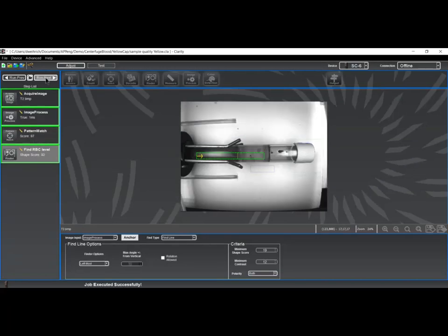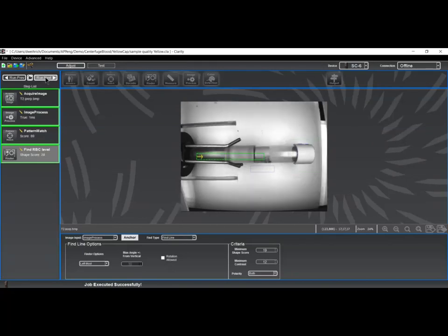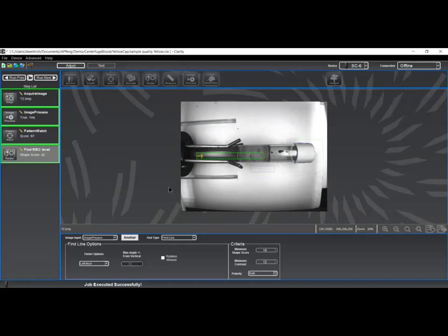So as I go through the different samples, if the cap is off from the previous sample, the region of interest aligns itself with the cap position, so that I'm always looking at the same general area of the test tube as I go through and look for this level. Again, we're looking for a line. We're finding a line that goes from darker to lighter. It has a reasonable distinctness. These are all parameters that experimentally are worked through here using contrast adjustment and shape and length. And of course I'm looking for the first transition, which is the blood to serum transition, so it is the leftmost transition.